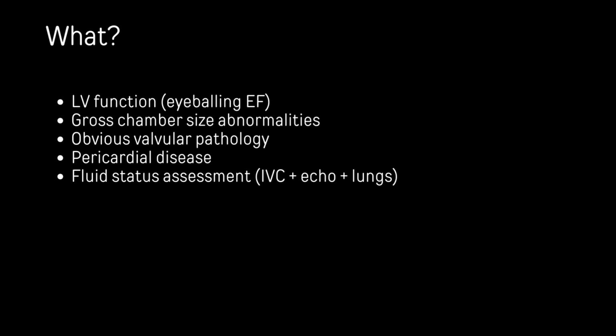Okay, and then we want to do something about fluid assessment. Now, this is quite complex and there's no one view that you can do that gives you an answer. It is context specific. What's wrong with your patient? Is this trauma? Is this sepsis? Is this cardiomyopathy? Is this calcium channel blocker overdose? All of these things you need to put together. But there's definitely some things that can help us with that assessment.